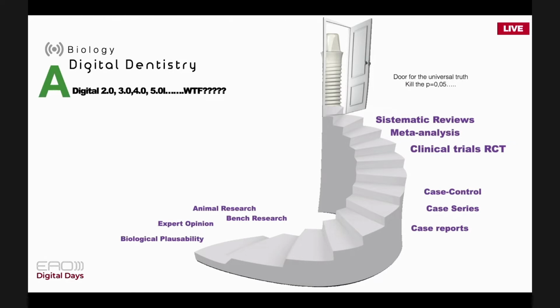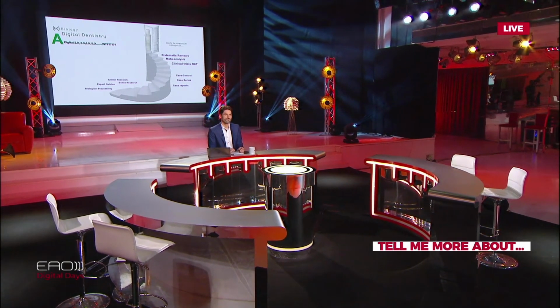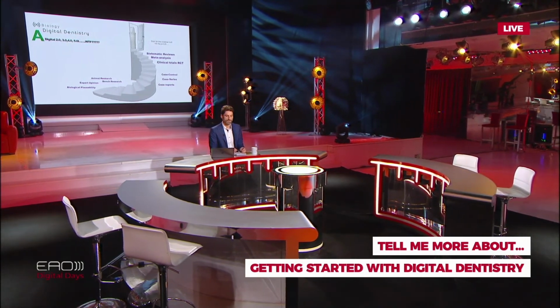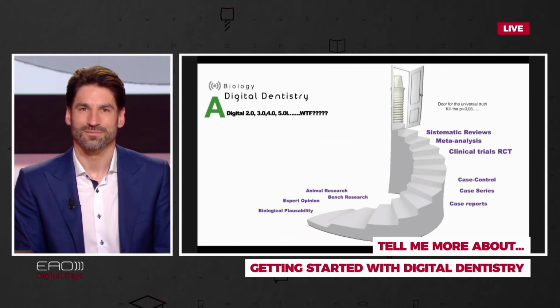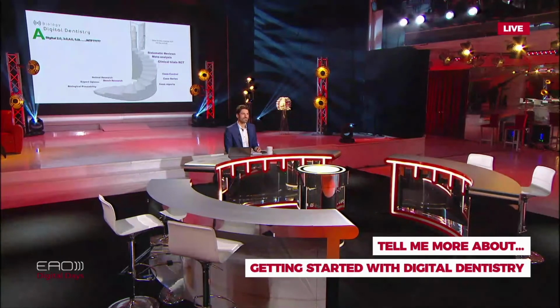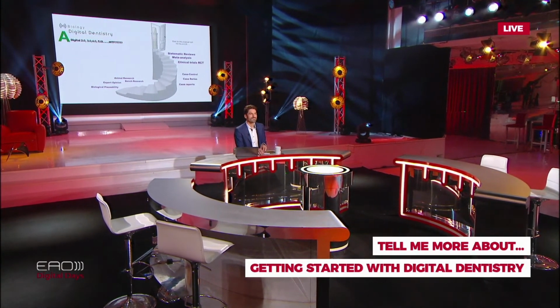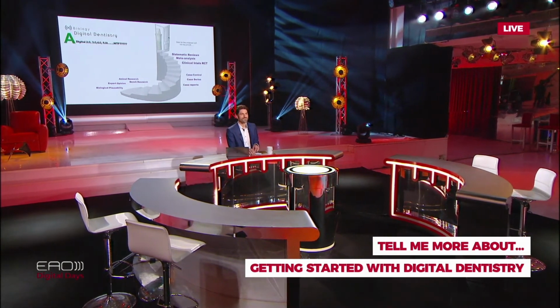So if you're doing a randomized clinical control trial about an intraoral scanner, and because you know that these clinical trials take a lot of time, sometimes when you have the answer, probably the software is already in version 4.0 and then it becomes difficult to keep track of these technologies. In the past, we didn't have that problem because the digital technologies wouldn't arrive from one year to another. So we had a problem there.